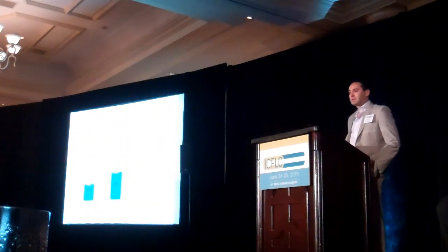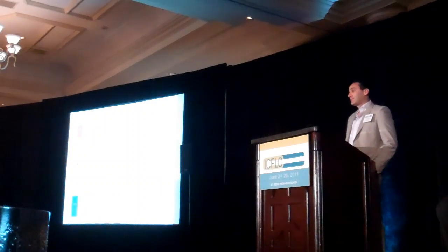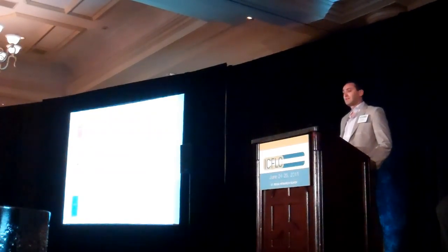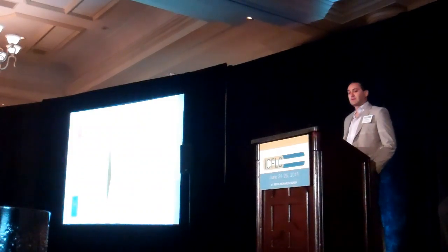How important is corneal astigmatism to all of this? I would argue that it's fairly important. Almost 90% of patients have some degree of corneal astigmatism before cataract surgery. We have several ways to address this. We can do it in the operating room with a manual LRI or arcuate incision, with a toric intraocular lens, or with a femtosecond laser. Each one of these approaches has pros and cons.